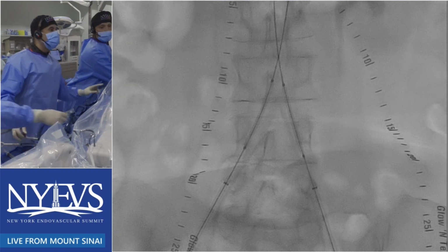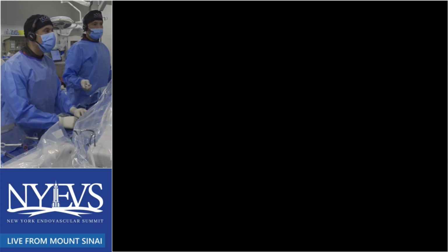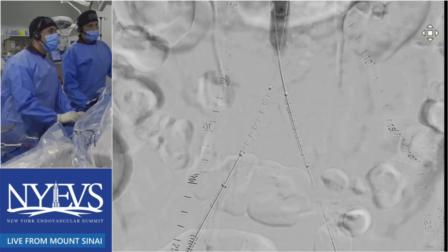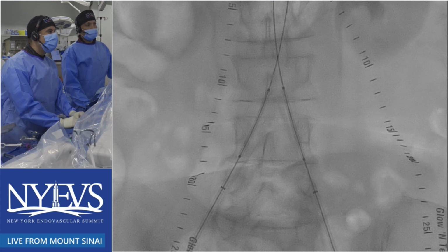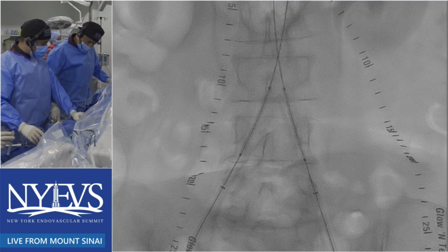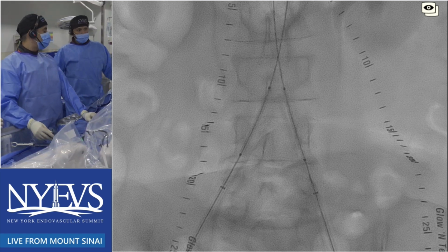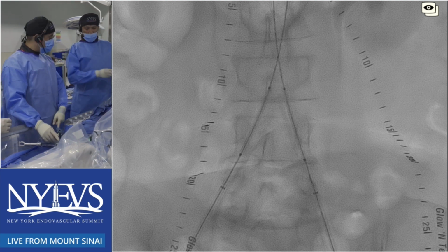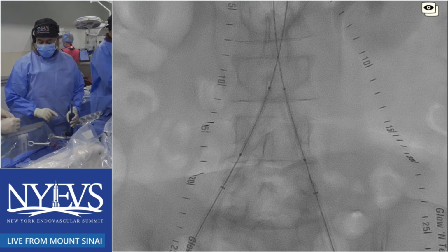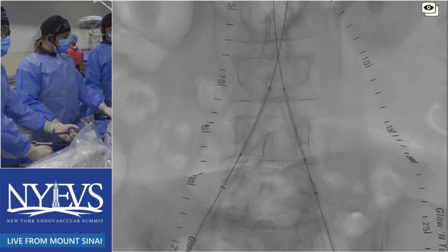To elaborate a little bit more on the DISCOVER trial, the Dutch trial, where they looked at uncovered versus covered, they didn't use IVUS because that's not available or reimbursed in the Netherlands, but they did use intraarterial pressure measurements on several occasions during the procedure. And what they actually showed is that you need to do more with an uncovered stent. You need to get it right. It's less forgiving than using a covered stent. Probably you can still leave some residual stenosis with a covered stent, and that is also probably the reason why in the COBEST trial, in the TASC A and B group, there was this drop within 30 days, all related to imperfections of the initial procedure.